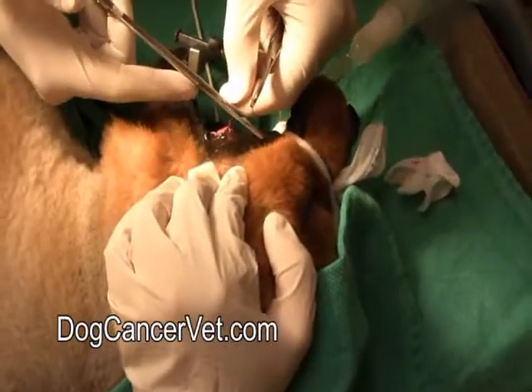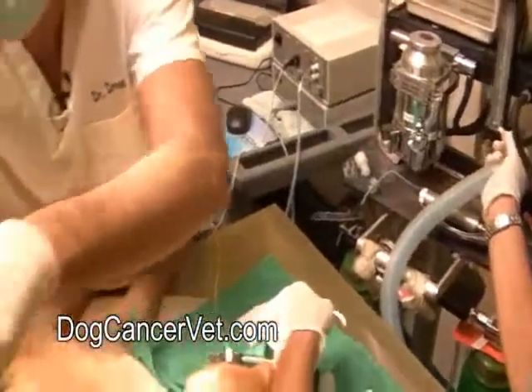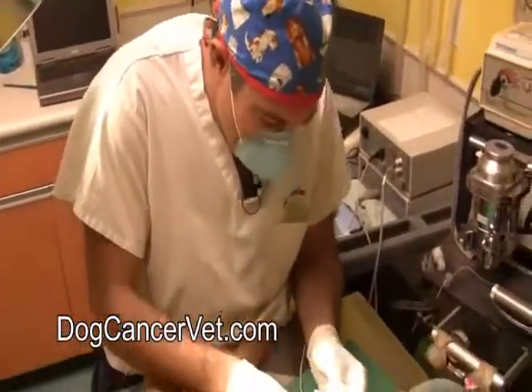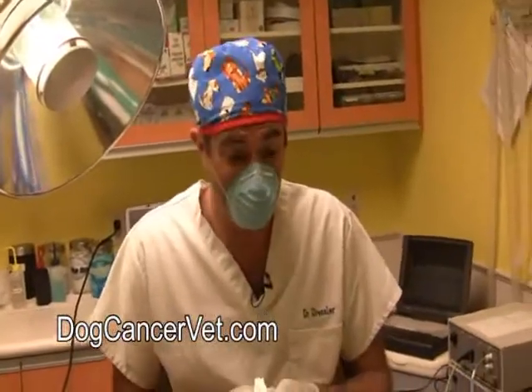We're going to turn our isoflurane - which is the gas - off, because we want to be waking this guy up now. We're done with the biopsy procedure. All that we're going to do now is just dab this off. He's already got his pain control medication on board, which I administered to him before the surgery, so he'll be comfortable when he wakes up. And that's how you do a biopsy.